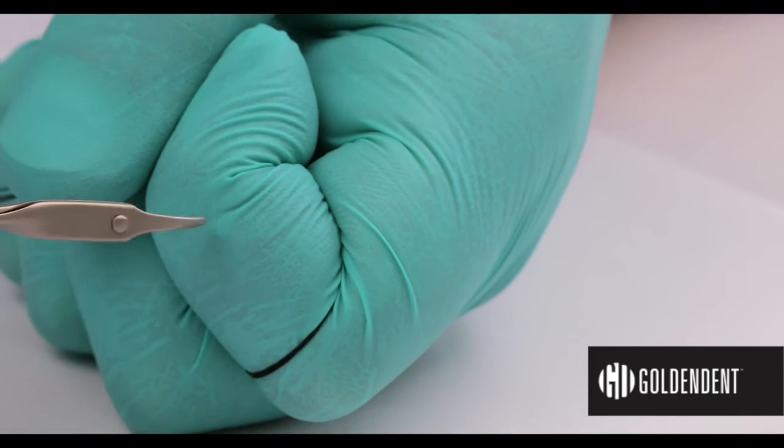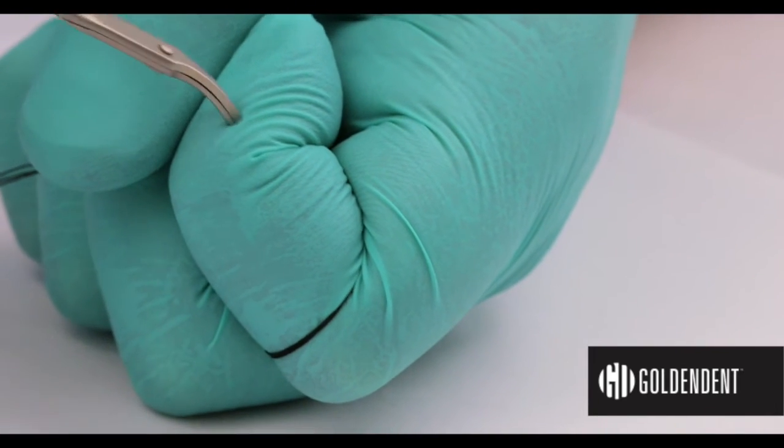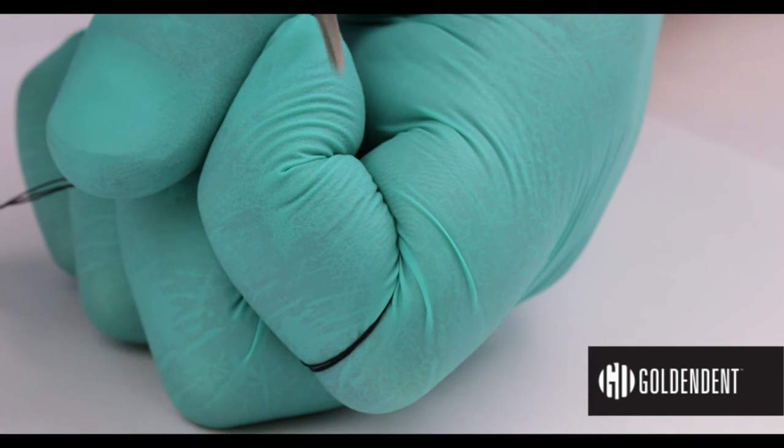And instead of trying to get underneath the suture or using forceps, the practitioner can simply snip the suture in one easy step.